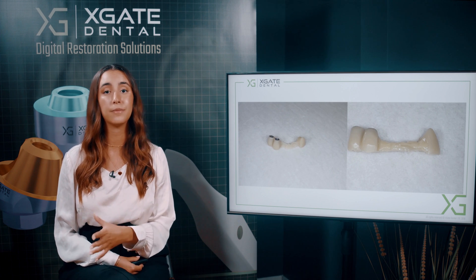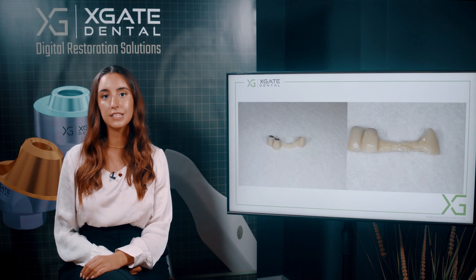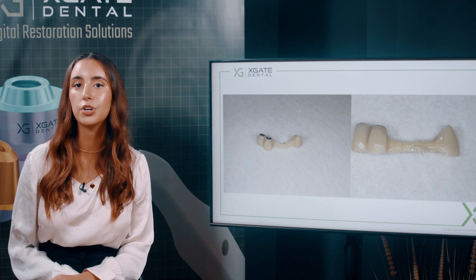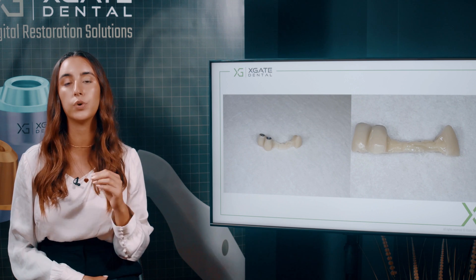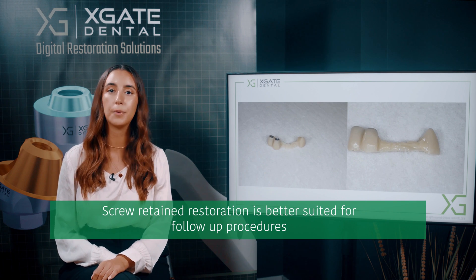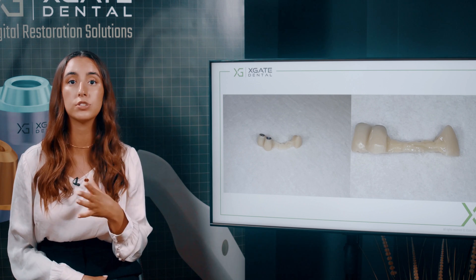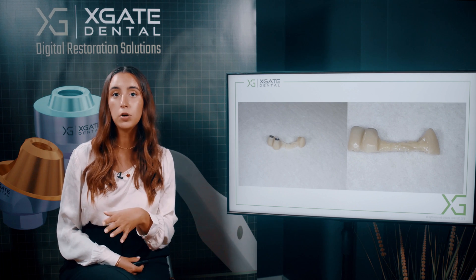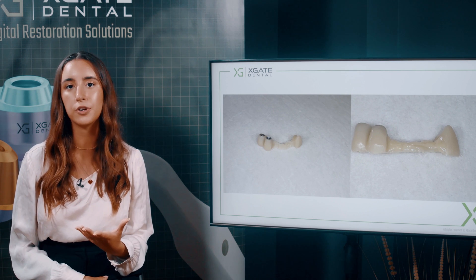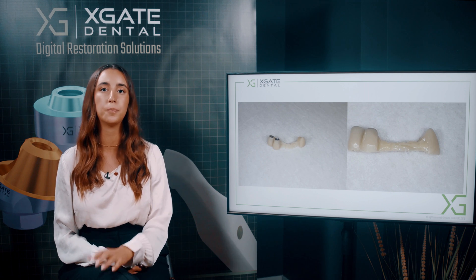When we take it out and give the Maryland bridge, you need to cement it back, because if it falls out the same day it can't even go one day without the tooth. Composite will stick to the temporary bridge and we'll just take it out as one piece. If we want to return it we can always do so by returning it with the screws. It would hold pressure, but it's made from PMMA. You need to know your capabilities — if you think it wouldn't hold, you can make it from a different material like PEEK or fiberglass reinforcement, and then add composite for the aesthetic on the buccal parts.